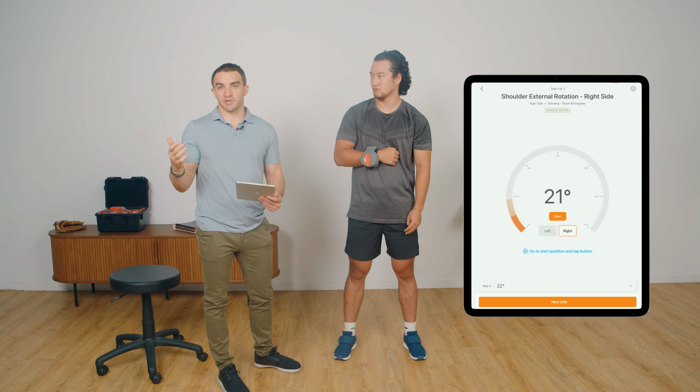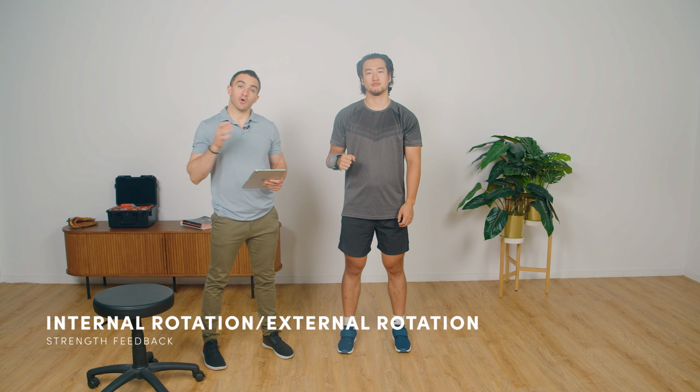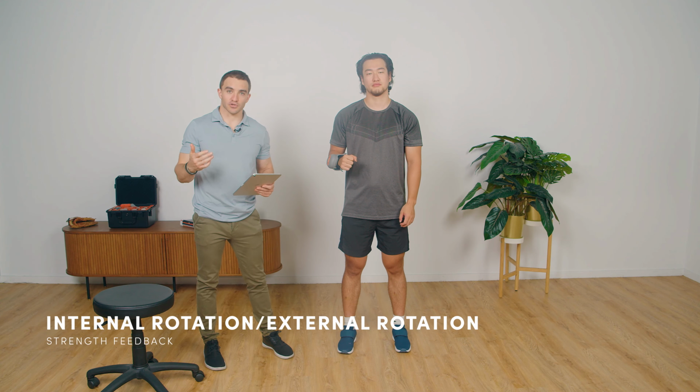Proprioception is often something that we see impaired after injuries and surgeries, but it's not something that we typically do well at assessing. So using something like an inclinometer can allow you to measure active and passive joint position sense by giving the patient a target to move to and then reassessing to see how well they can replicate that position. As with range of motion, there also might be restrictions on strength after surgery.